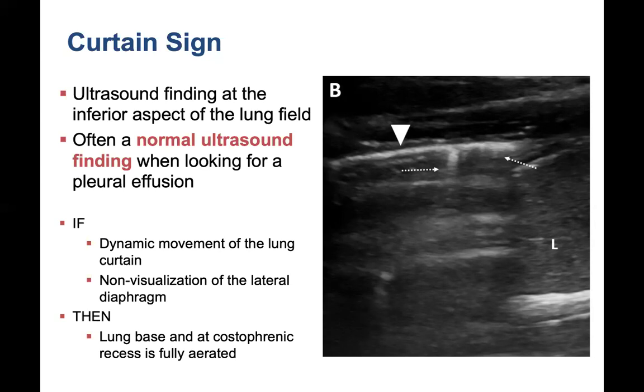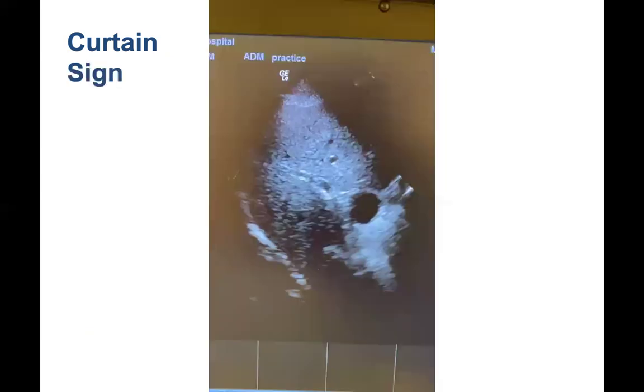And we said that the ultrasound beams don't like air. So they won't necessarily go through that lung if it's well approximated to see the liver. So what you will often see is part of the diaphragm, part of the liver, but then you'll see your visceral and parietal pleura kind of coming across as the patient breathes and obscuring your view of the liver or the spleen. So this is what that looks like on ultrasound image.